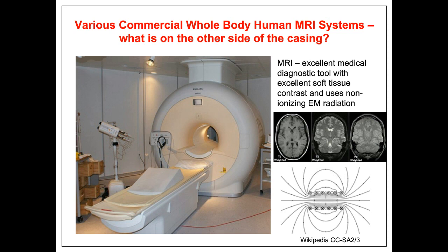So the intent of this webinar is to try to demystify what's going on behind that casing, to see where RF engineering fits into the MRI process, and to also talk about ways where RF engineers can contribute, or have contributed, are contributing, and can further contribute to advancements in the MRI field. I just want to say at this point that it's a very multidisciplinary discipline. I'm only going to be focusing on the RF engineering, but there's many other engineering disciplines, even within the broad EE community, that are involved in this.